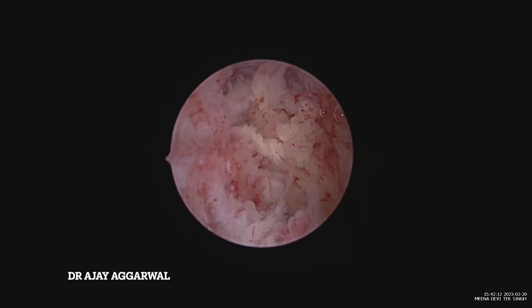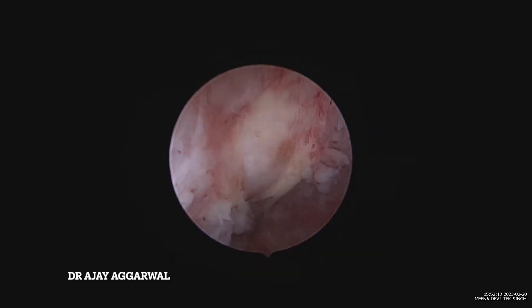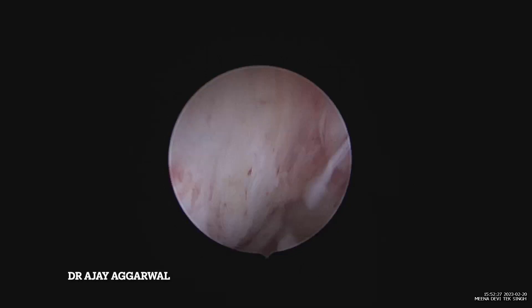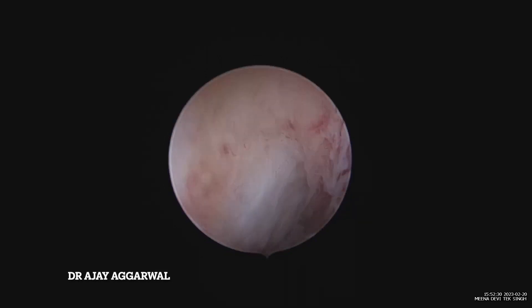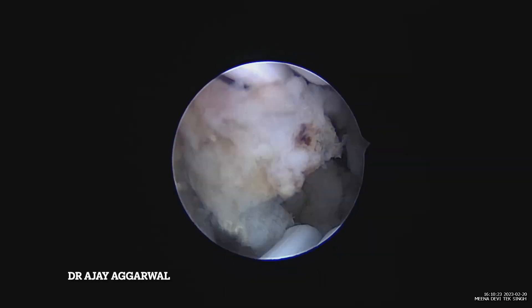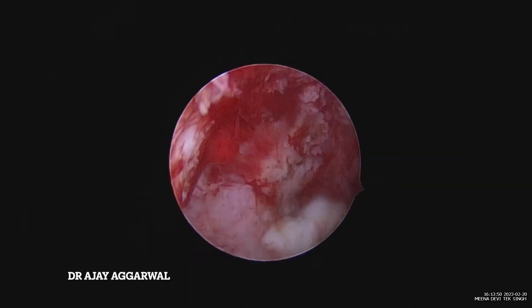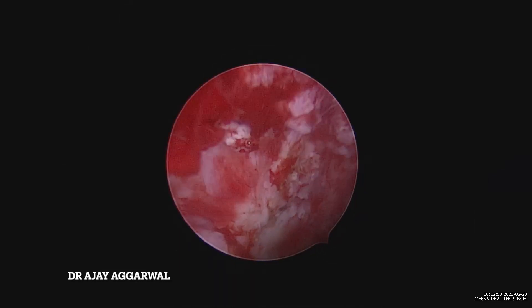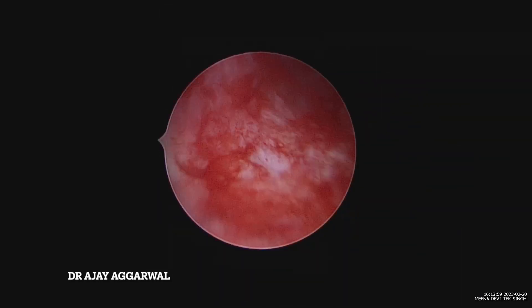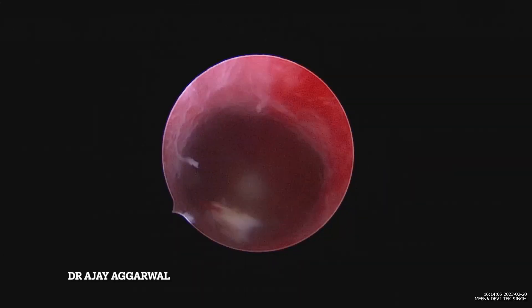This is the other ostia we can see. On the right lateral side, I could identify some tissue still left, so I rubbed it with the help of the scope and identified a fibroid. Once the fibroid was identified, I removed it with the scissor followed by the resectoscope — only the superficial part was cut and the deeper part was enucleated with the help of the scope. This is the final picture after the surgery with a nice cavity. I will put a Foley balloon in for one week, the patient will be on estrogen, and we will post her for a relook hysteroscopy after two months. Thank you so much — I hope you enjoy this video.